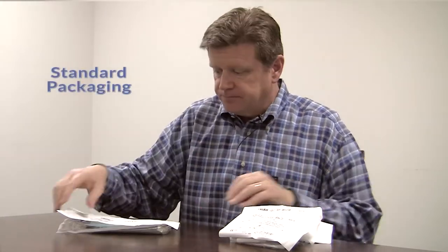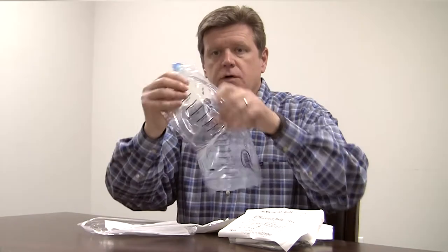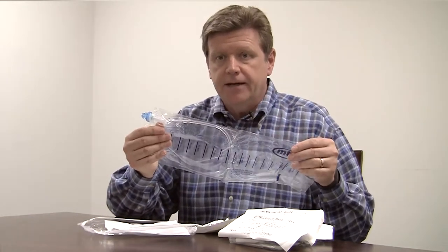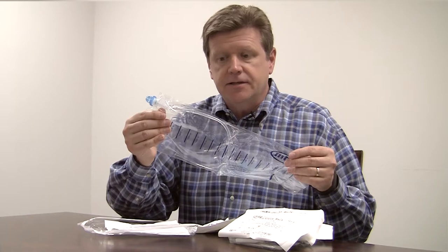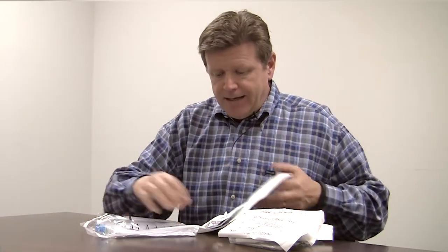Let's look and see what's inside the package. Our standard packaging, when open, includes gloves, an underpad, BZK antiseptic swab sticks, a gauze pad for clean up, and the catheter — the closed system catheter, pre-lubricated — and the bag acts as the collection device and also protects the sterility of the catheter.